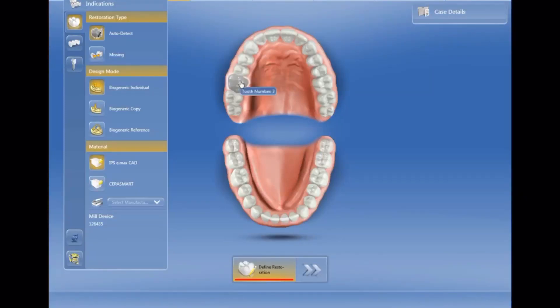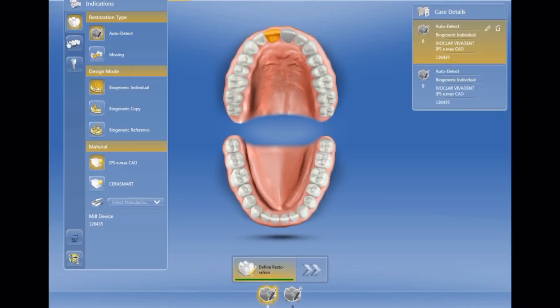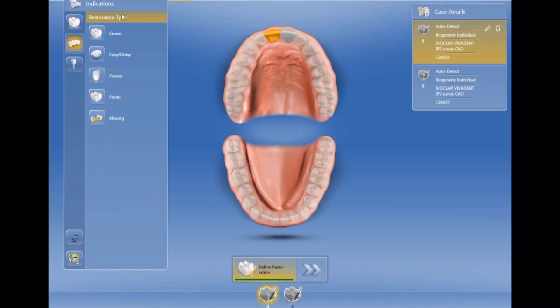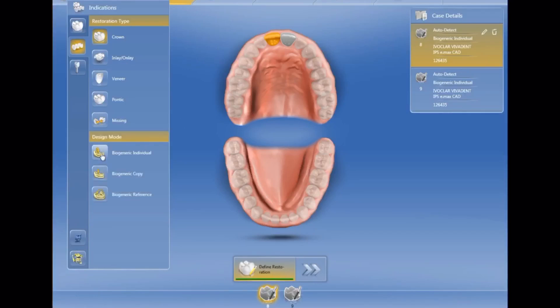This is the setup video that'll demonstrate how I set up the previous case with two adjacent bridges and two anterior crowns. I set up the crowns as biogeneric individual with CEREC, and now we're going to move to the bridge. I've selected the crown portion of the bridge as biogeneric individual.